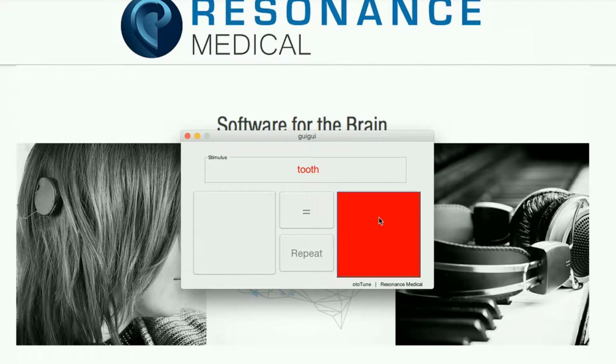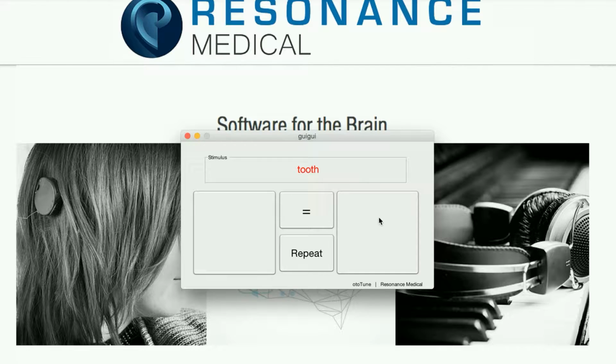So it's kind of similar to what you do when you go to the optometrist, right? Where you're looking at these set of letters in the back and using different lenses, and you're telling the optometrist which one is more clear, and he's able to use these questions to pinpoint the best prescription for you. And so it's, in principle, at least on the surface, similar to that.